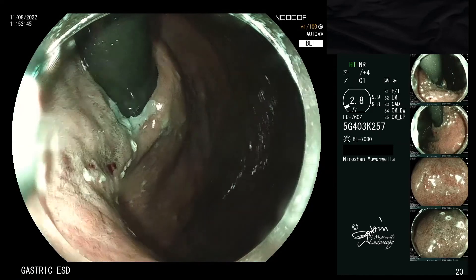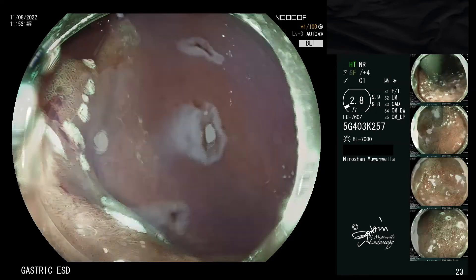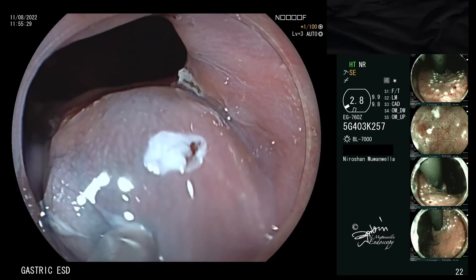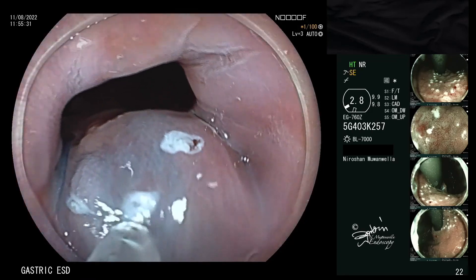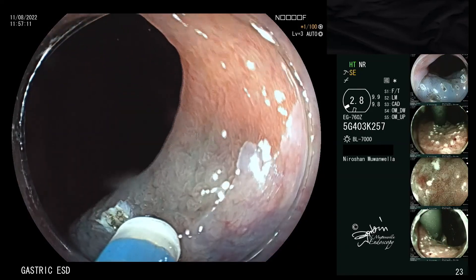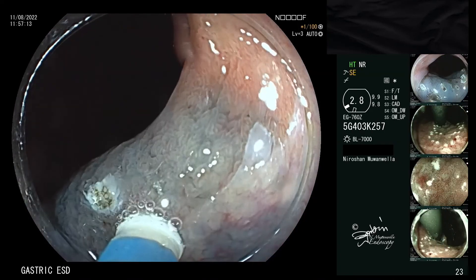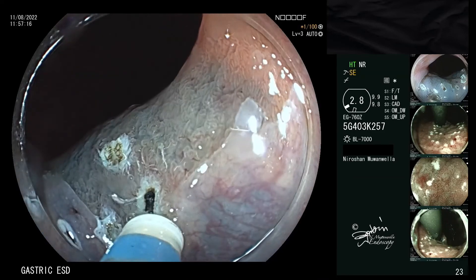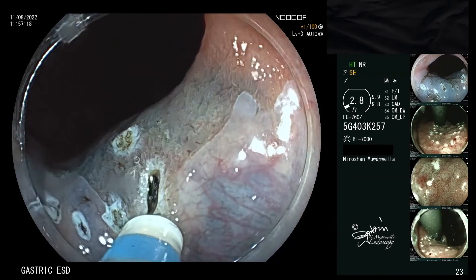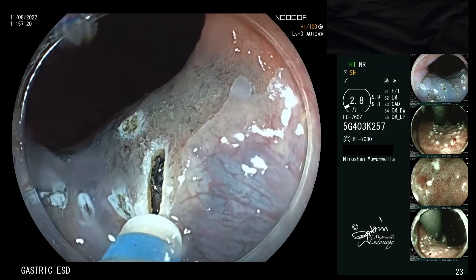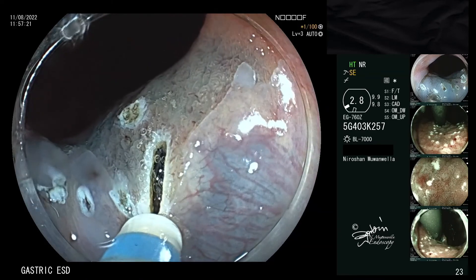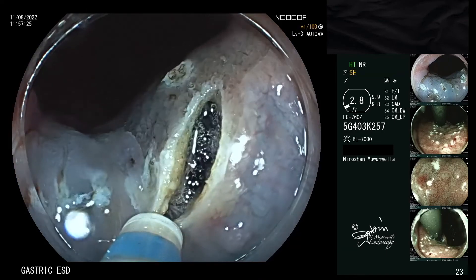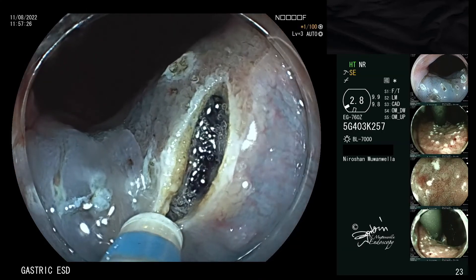The resection is started at the oral aspect. Following submucosal injection of a lifting agent, ideally the mucosal incision should be started at the 3 o'clock position. As the knife exits the gastroscope at the 7 o'clock position, this area would be the most difficult to approach, and therefore should be dealt with at the beginning.